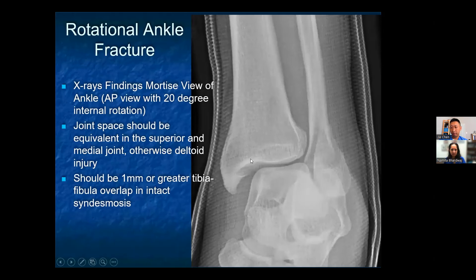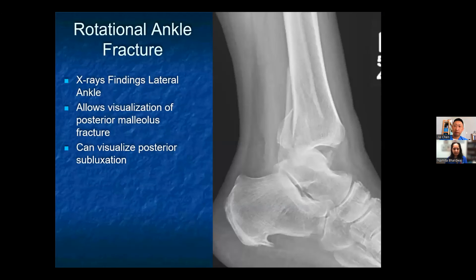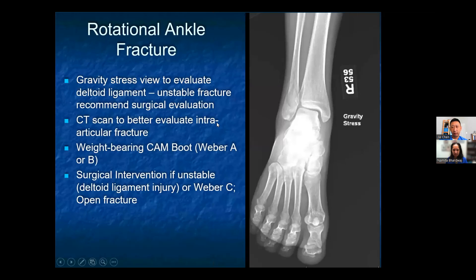On the mortise view, the joint disruption is clearly visible — it won't look as congruent as a normal ankle because the mortise is disrupted. The medial clear space is definitely wider than the tibio-talar space above and the lateral clear space. On the lateral view, it is very important to assess for posterior dislocation — the talus may not be sitting underneath the tibia and can appear posteriorly subluxed. A posterior malleolus fracture fragment may also be visible. Additionally, a gravity stress view can be helpful when the medial clear space is equivocal after a distal fibula fracture.